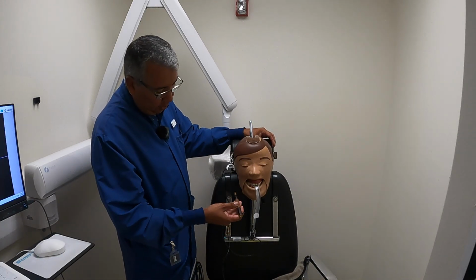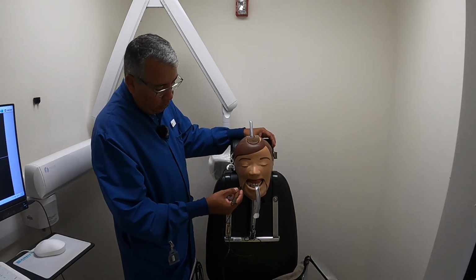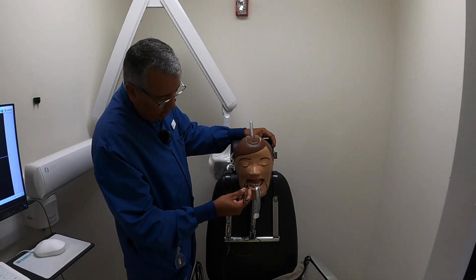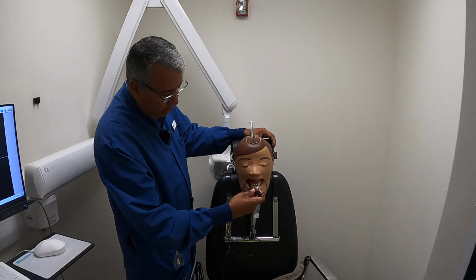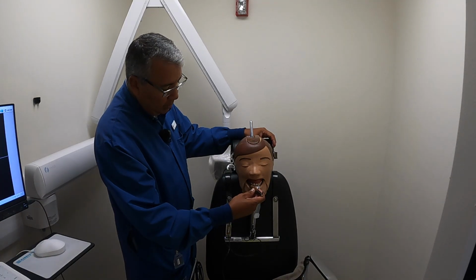If we were taking the premolar and trying to find the horizontal angle, we could use a pen as a reference for now, but we're going to wean ourselves off of it. The horizontal direction of the premolars, using the second premolar, first premolar, and the lateral. All four of those teeth collectively, the horizontal angle comes in like this.